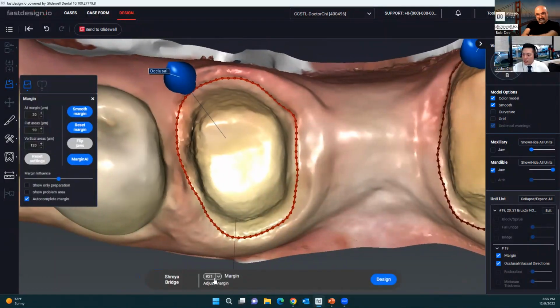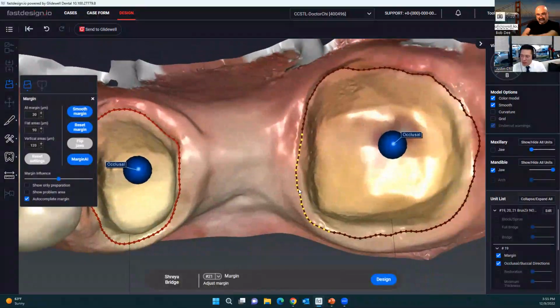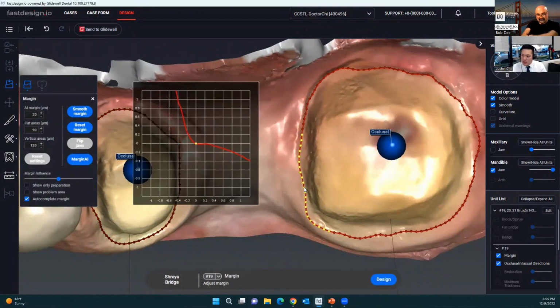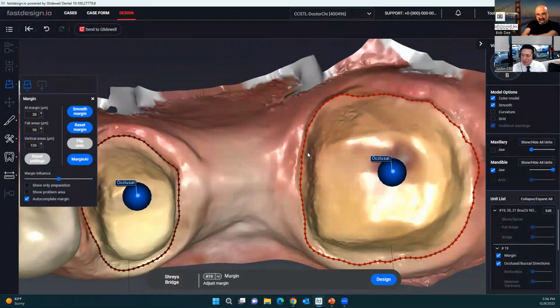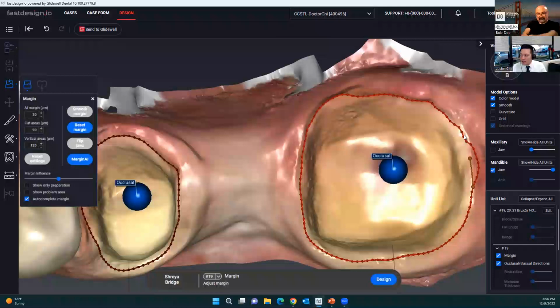So if you see on the bottom of the screen, I had set this case up as number 19 to 21. And it's kind of one of the tricks in the software. If I set it as the true number, 18, 19 as the pontic, and 20, the software would squeeze in, since the restorative space for the pontic is relatively small, a really small molar. So what I do is I change it from 19, have the pontic be number 20, so that way I can have premolar anatomy right into that space for the pontic. And so just one of the tips as far as setting the case up.